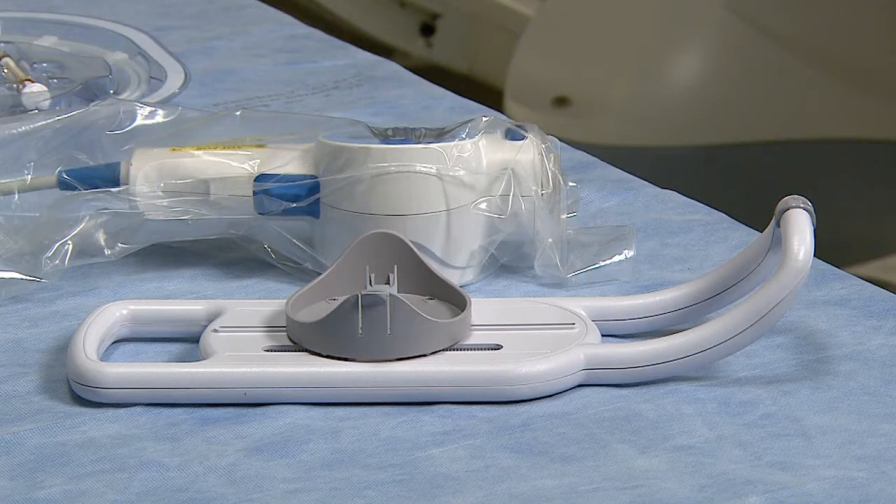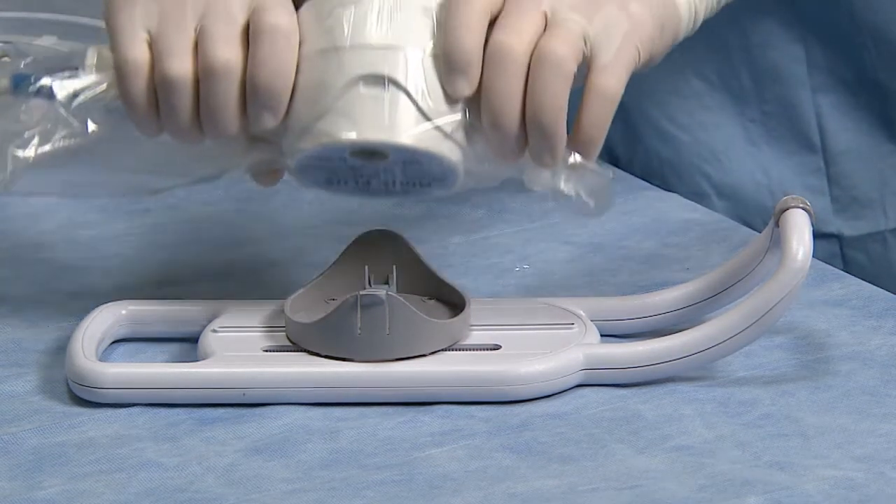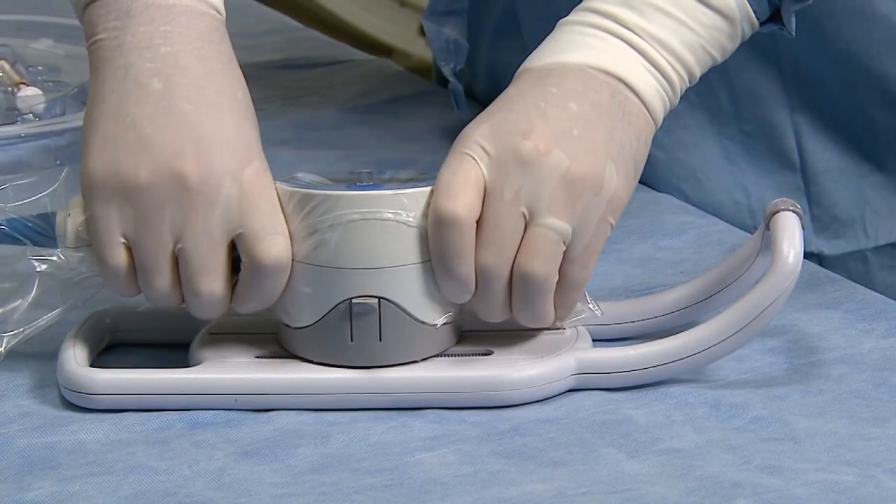The motor drive may be used with an optional pullback device. To attach the motor drive to the pullback device, place the heel of the motor drive into the cup of the pullback device and, using a rocking motion, roll the motor drive forward until it snaps into place.